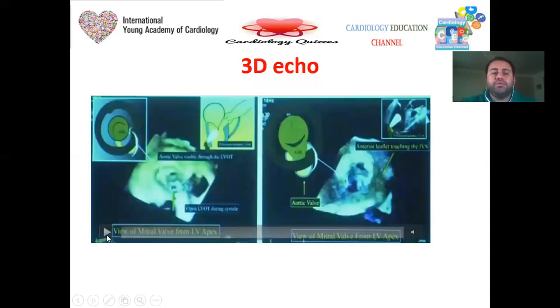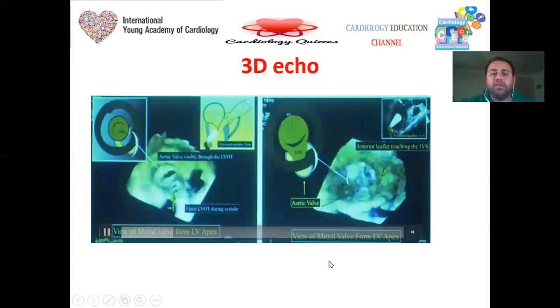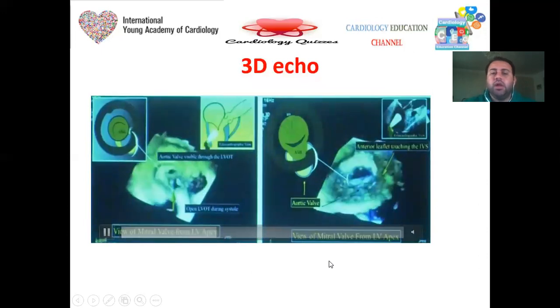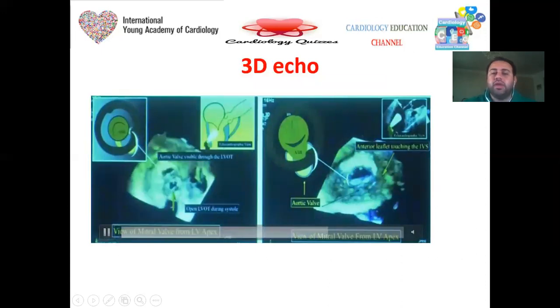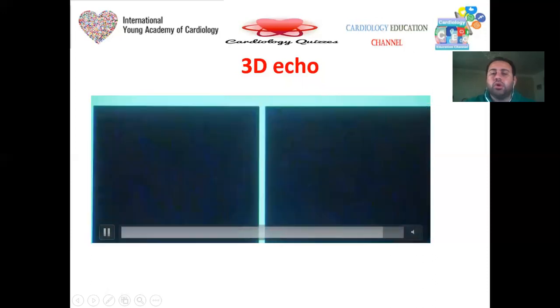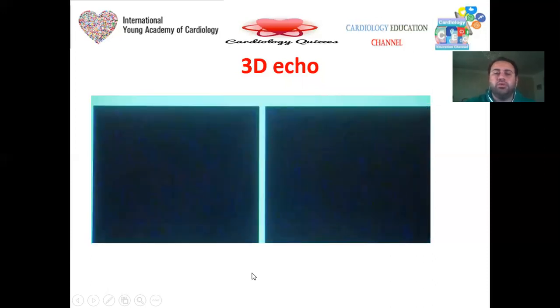3D echocardiography for demonstration: in normal 3D echo, the mitral valve and LVOT are patent. In HCM with SAM, the anterior mitral valve leaflet is shifted towards the LVOT, which is almost completely obstructed due to the presence of SAM.